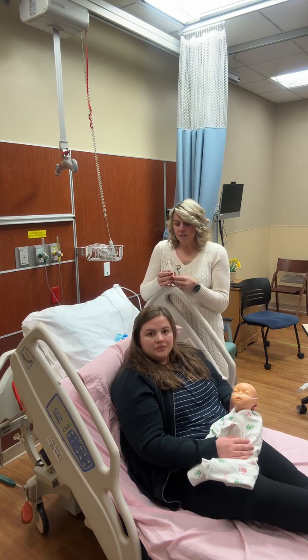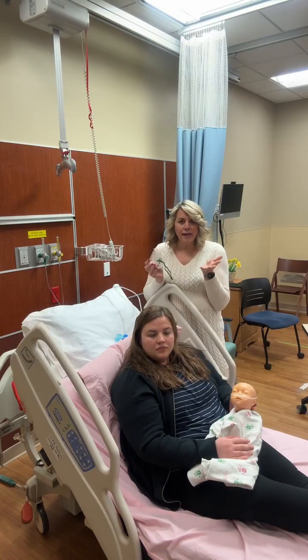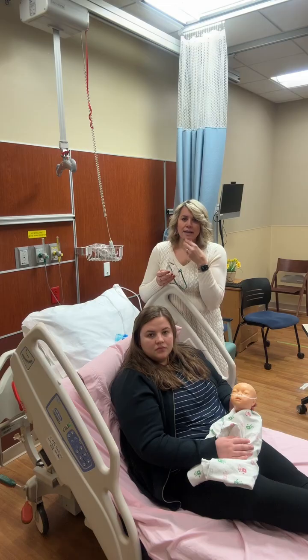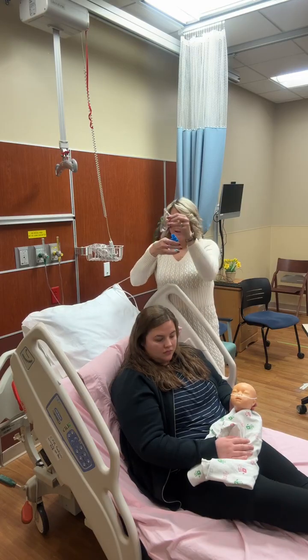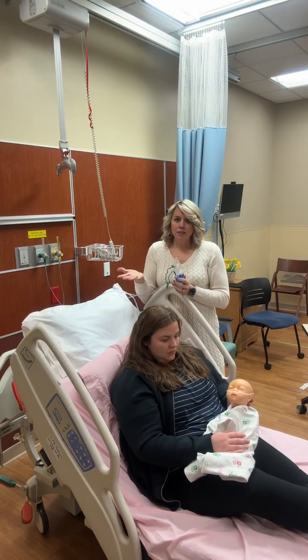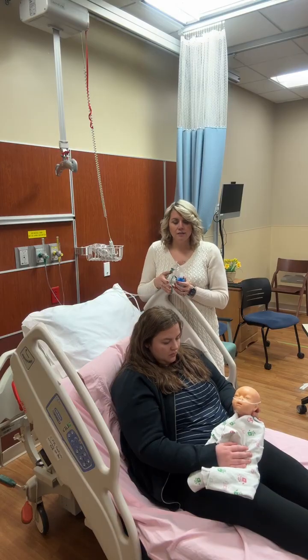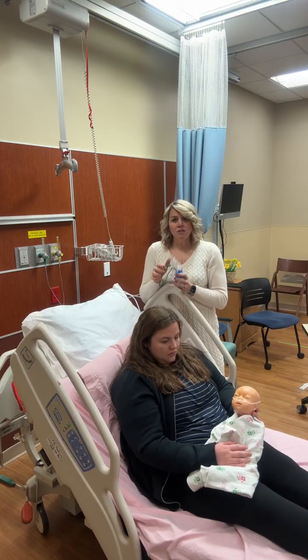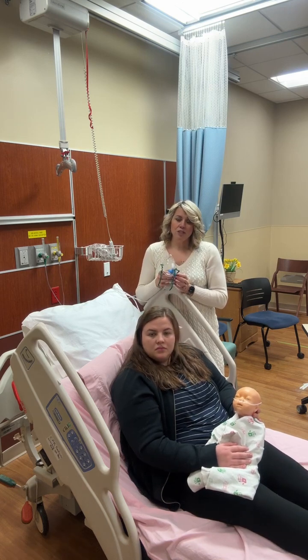And in some situations, the pediatric patients, usually like your 4 to like 9-year-olds, they have specialized masks that look like little dinosaurs or polar bears or something like that. And they would connect just like a normal mask would connect to the nebulizer cup. And you would instruct the child the same way you would, but in terminology for a child to understand. And so in that situation, a mask is okay if the patient is going to tolerate it. But let's say we have a situation where the mask is not appropriate.